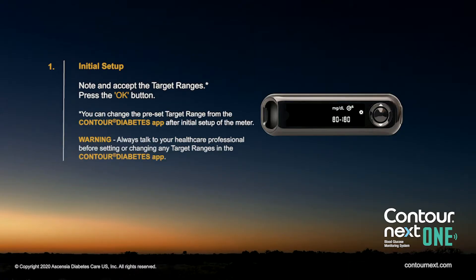Make note and accept the target ranges, then press the OK button. You can change the preset target range from the Contour Diabetes app after initial setup of the meter. Warning! Talk to your health care professional before setting any target ranges in the Contour Diabetes app.